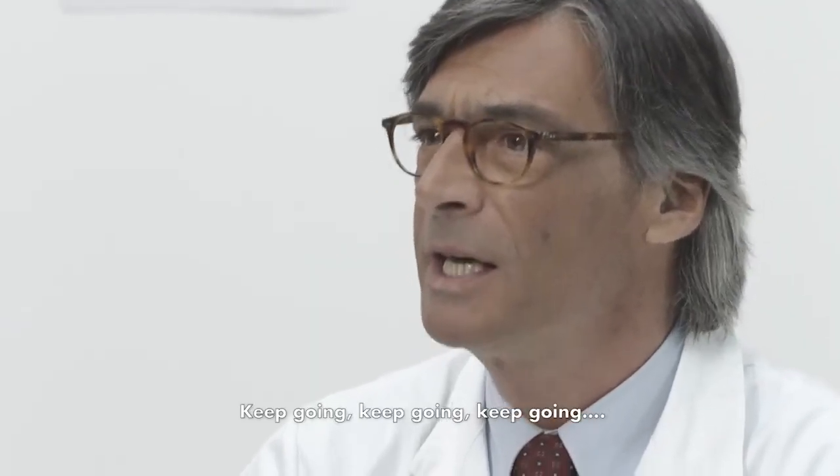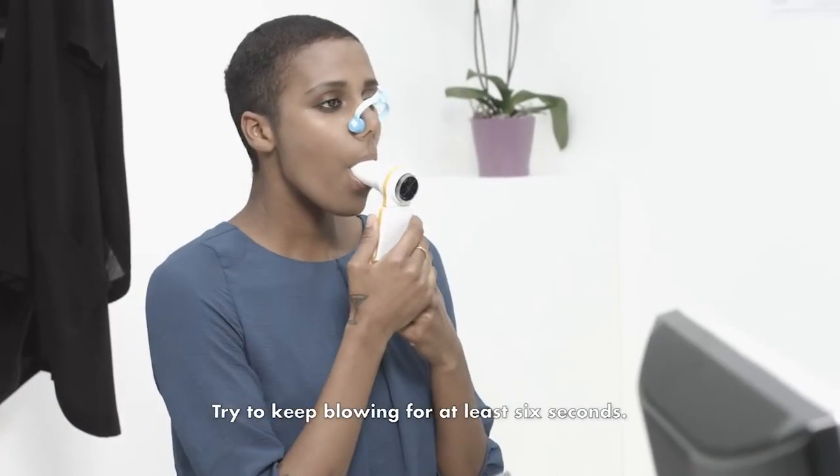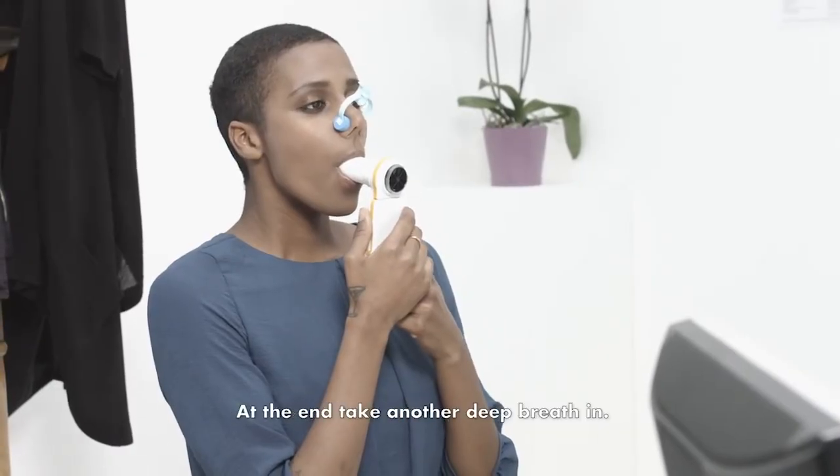Pretend you are blowing out the candles on your birthday cake. Keep going. Try to keep blowing for at least six seconds. At the end, take another deep breath in.